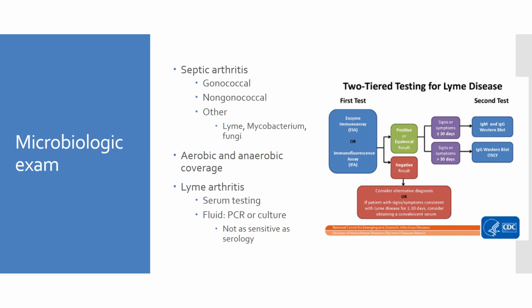If you are going to collect culture on this, and if you can get enough, you can use blood culture bottles. They're very good. But remember, some of these are very fastidious. So if you don't get it in the bottle very quickly, Kingella, for example, which is not uncommon in a fluid, is quite fastidious. GC is fastidious. So it needs to get in the bottle quickly.